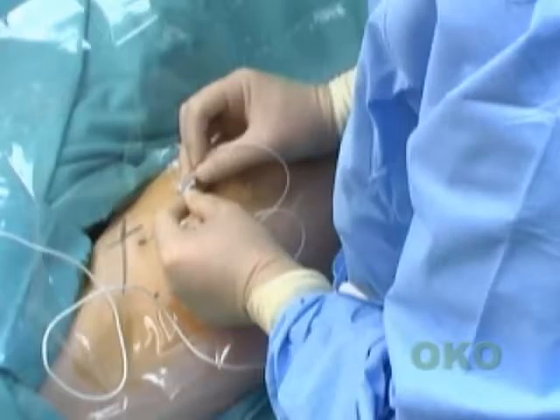In young, healthy, fit adults, this may require many attempts, and patience is usually required. If the catheter is placed without quadriceps stimulation during catheter advancement, it simply means that the catheter is not on or near the nerve, and the block cannot be expected to be successful.